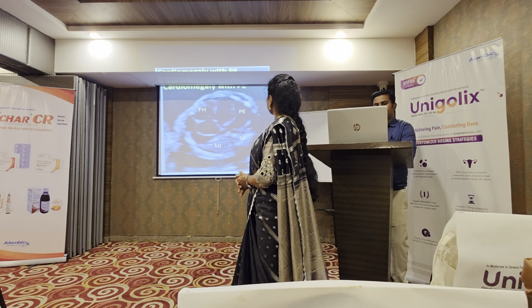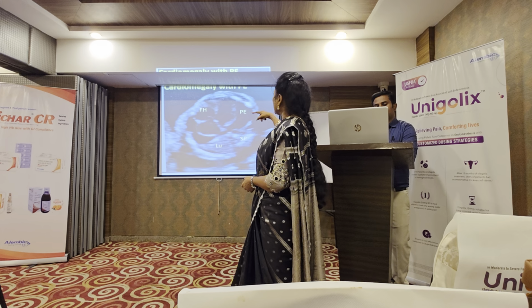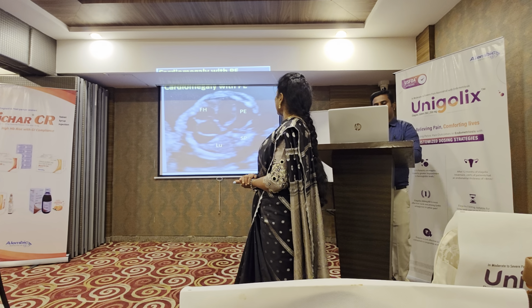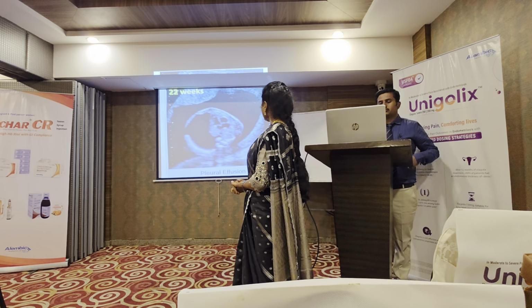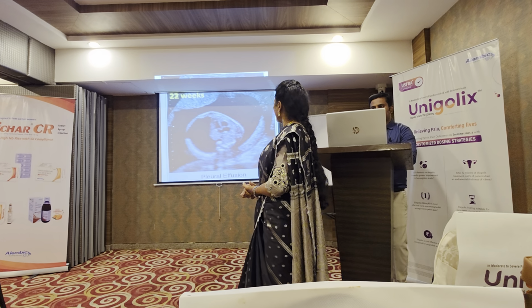Next one. That is the heart. In the same baby, we could see pericardial effusion and both the lungs pushed to one side, heart almost occupying the entire thorax. Next one. Here also it's the same thing. Pleural effusion, pericardial effusion, heart pushed to one side.